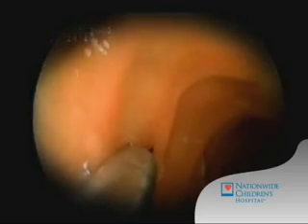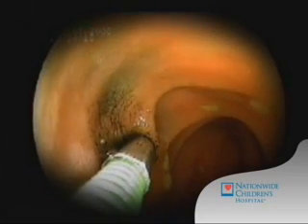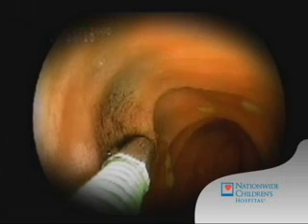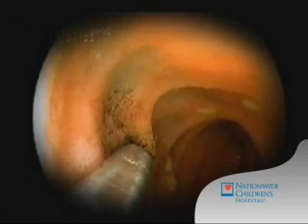We'll then go back and retrieve that lesion for examination under the microscope, and then again label this as our farthest point by leaving a small permanent ink mark, or tattoo, at the wall of the small intestine.